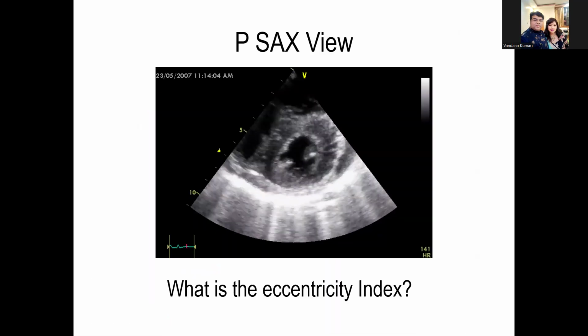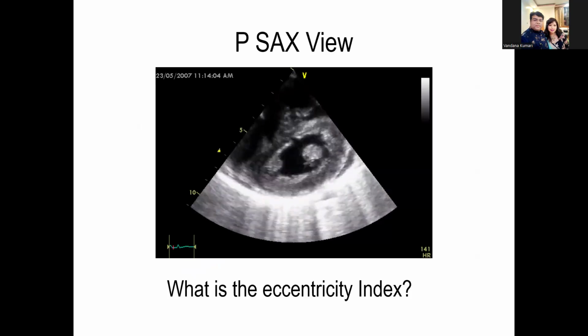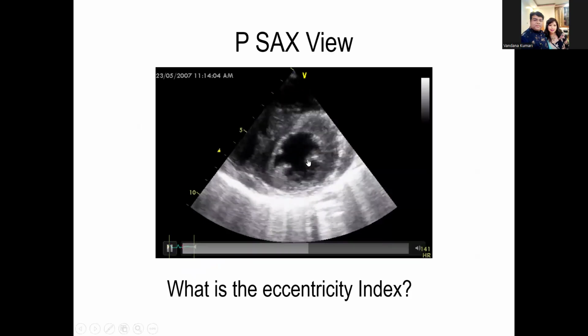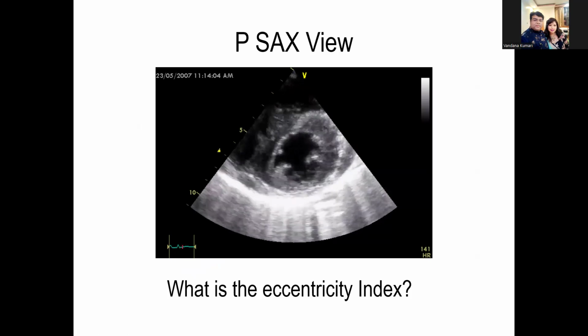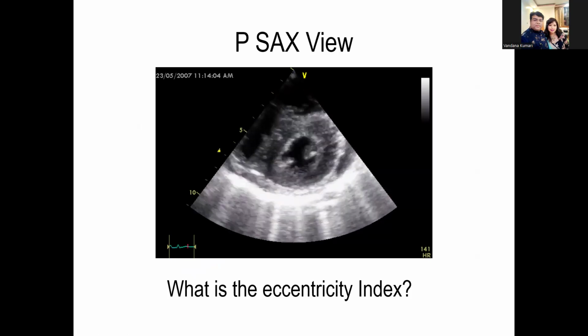In this picture, if you look carefully, what do we see? With every systolic contraction, this septum is bulging towards the LV. Is that clear or not? Yes, sir. Clear now. So this is what we are looking for.